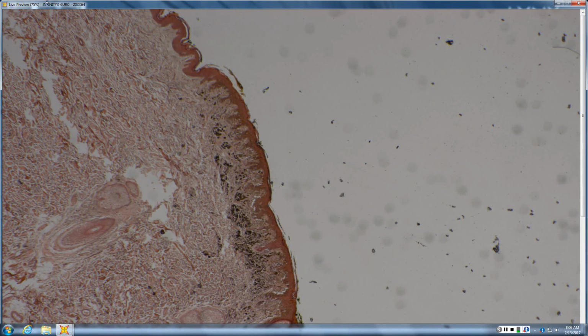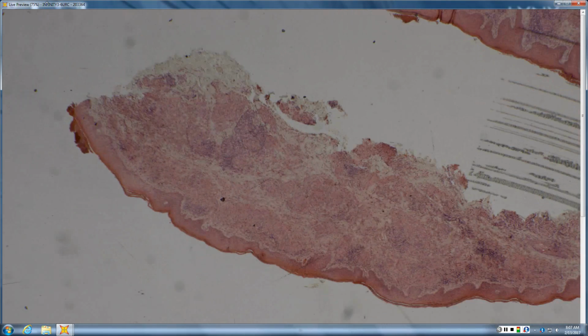And it's proximal extremity of a young woman, and it is well circumscribed, ends in a nest, looks kind of spitzy, hyperkeratosis, PEH, hypergranulosis, but is darkly pigmented, and whereas Spitzes are composed of large spindle and epithelioid cells, these are composed of small spindle cells only. Very good. So depending on whether you're a lumper or splitter, it's either a small cell Spitz, or it's different because it's small cell and not head and neck of kids.